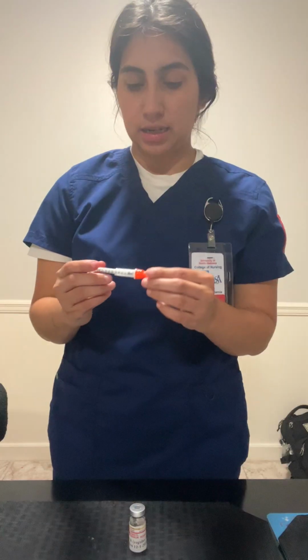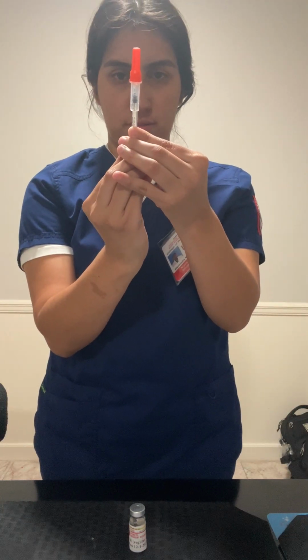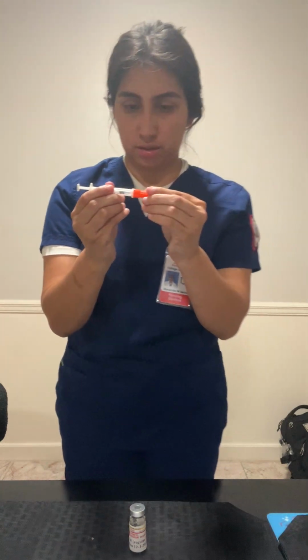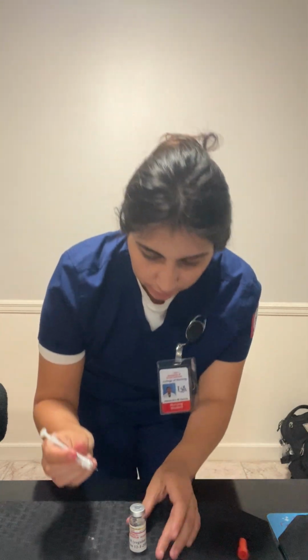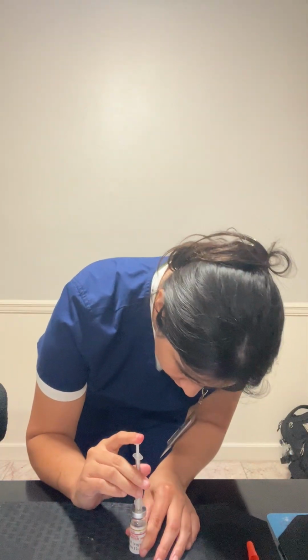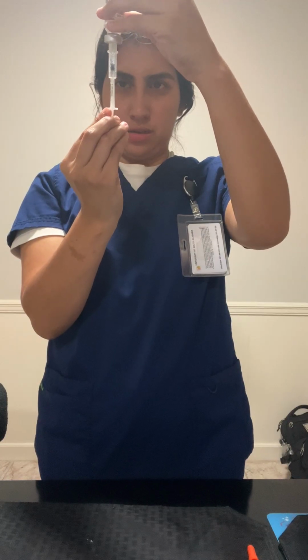Okay, now I'm going to pull 10 units of air. I'm going to open it and then puncture and push the air, flip the vial, and pull 10 units of insulin.